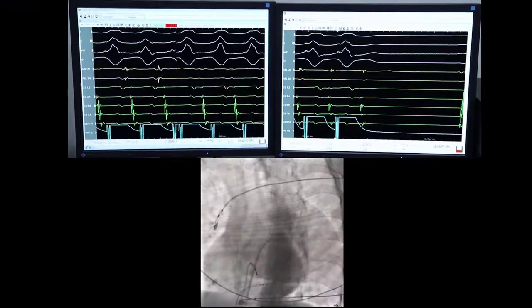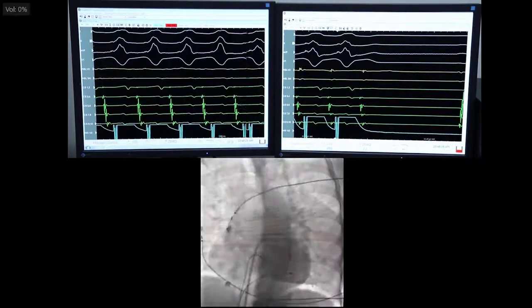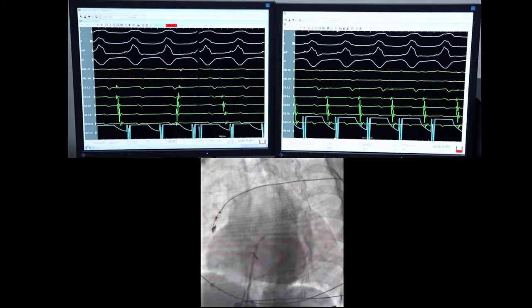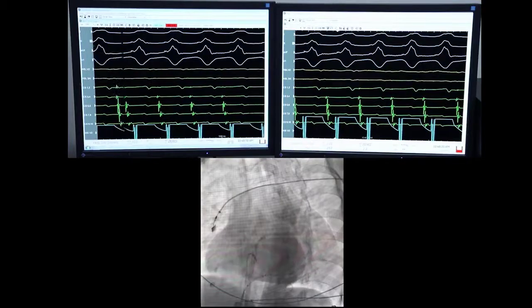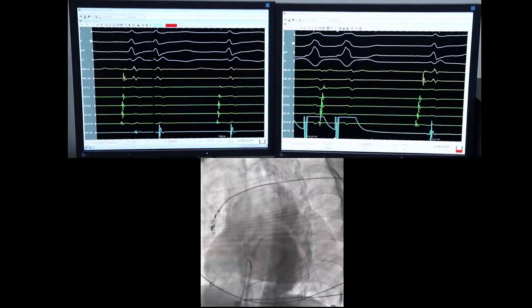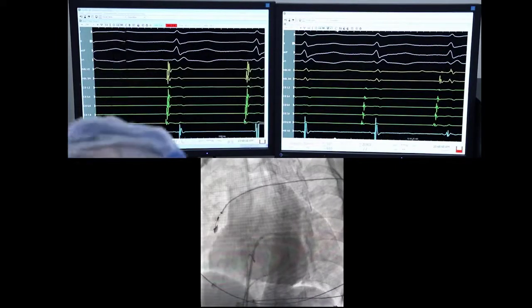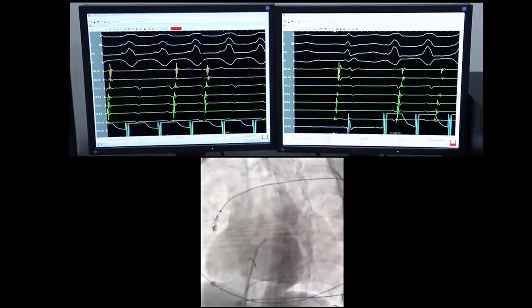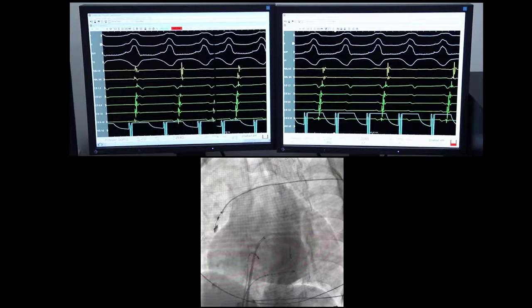We can see here the ventricular pacing from the right ventricle with the eccentric activation with the shortest VA time on the ablation catheter, preceding all the A signal on the CS catheter. We got this signal at almost the left posterior to left posterolateral region.